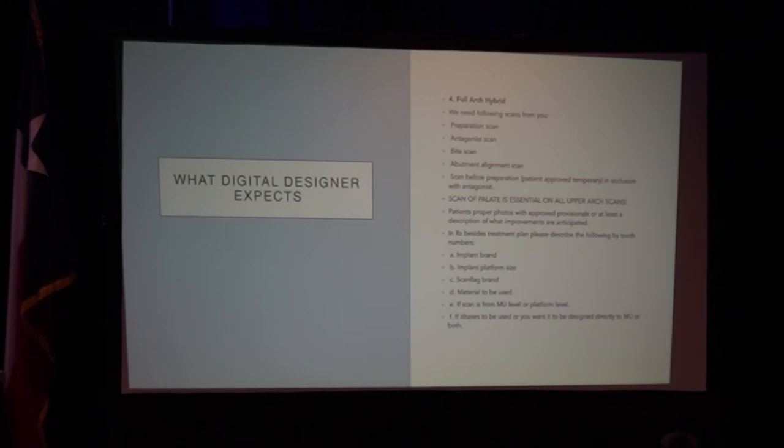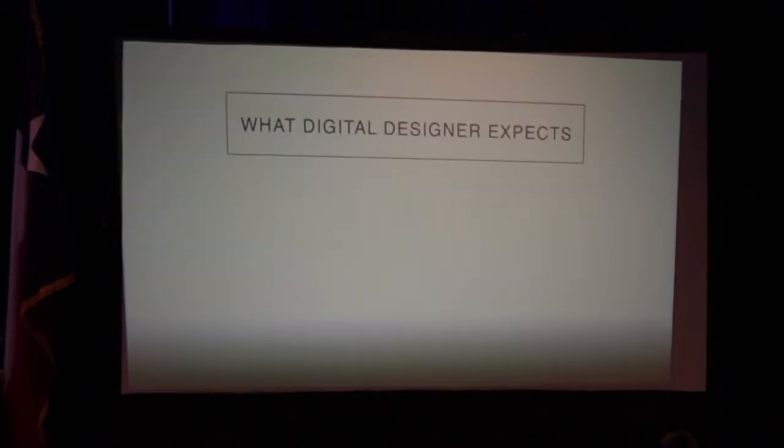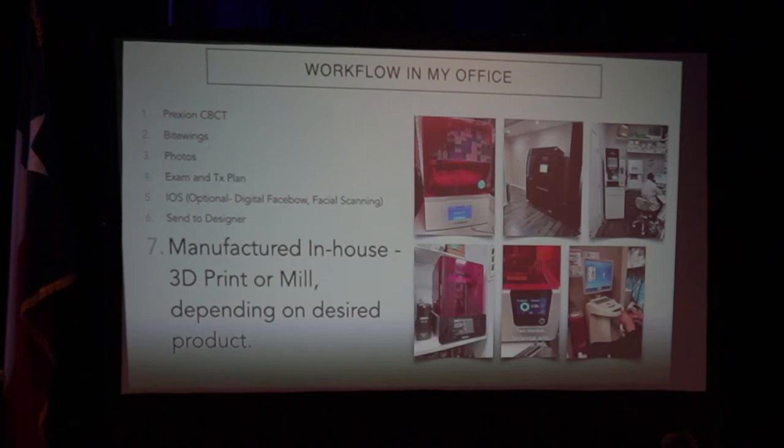Beyond the scope here, but I actually have a digital articulator now, so I do zero adjustments on all my cases. So communication is the key, in an analog world or a digital design world. Okay, so the last part: manufacture in-house, 3D print, or mill.